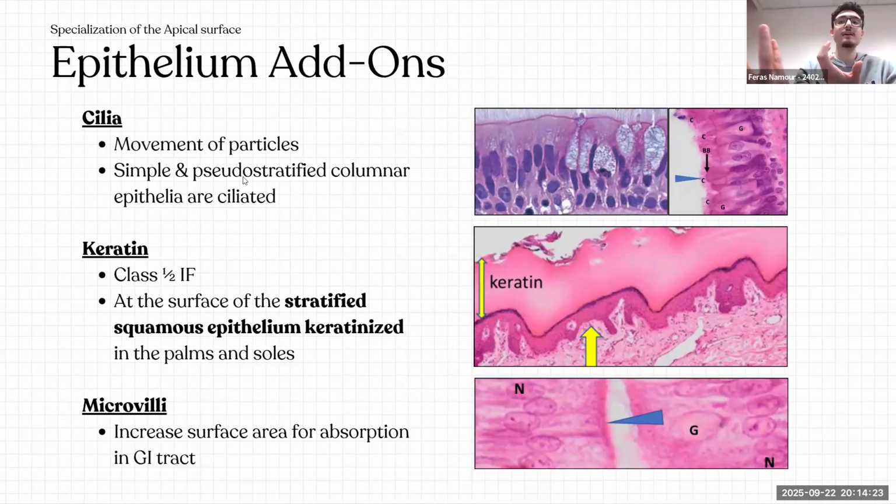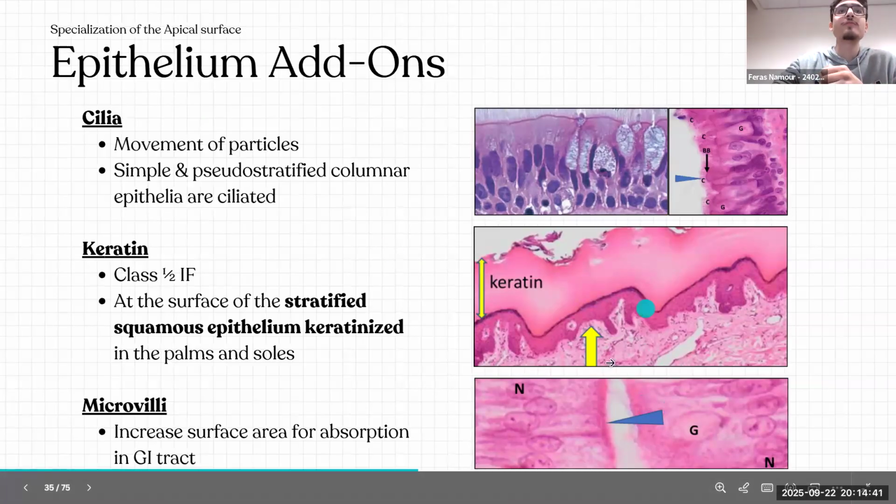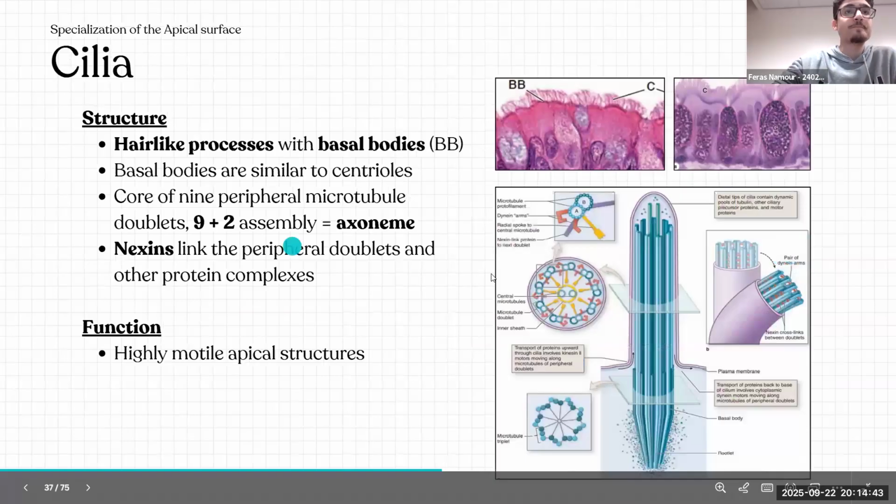It's like a hazy thing, but you can point it out. Why is it not visible, yet visible at the same time? Because when you don't have it, the apical surface is clear. It's white. There's no pinkish haze. But when you have this pinkish haze, you have microvilli. All right.